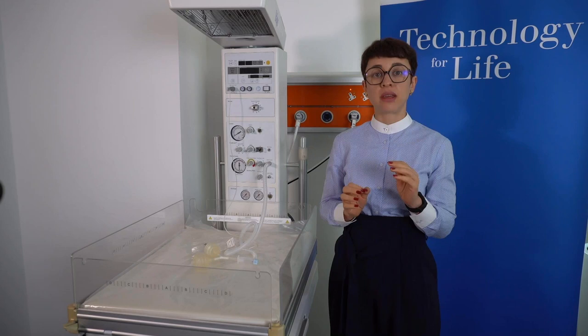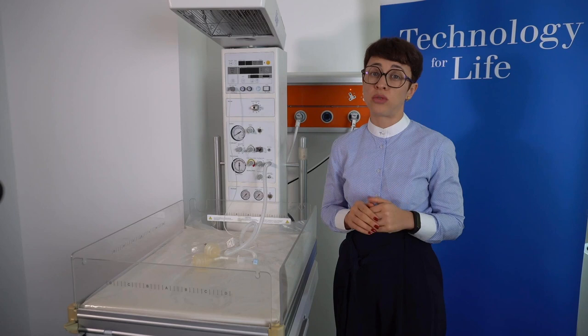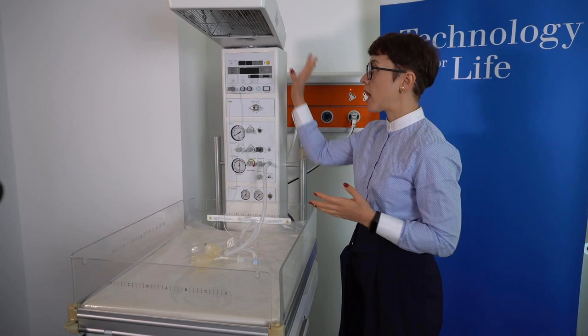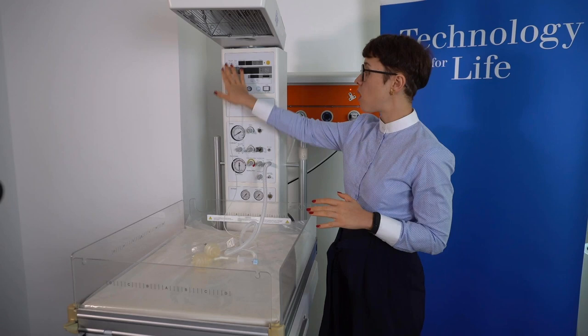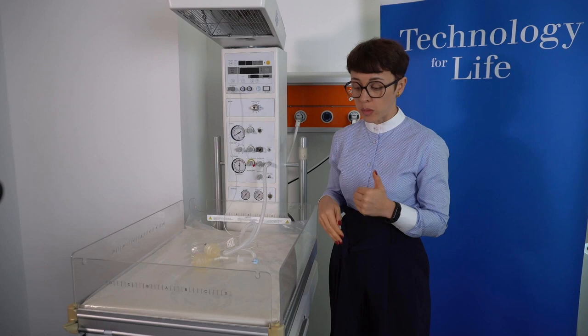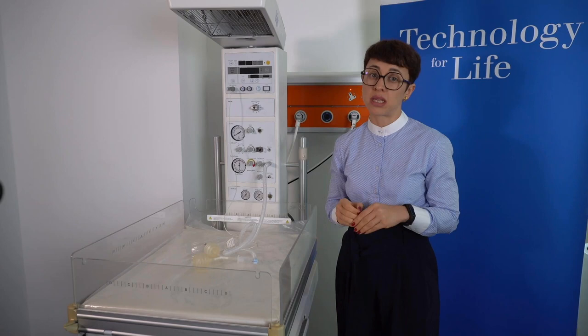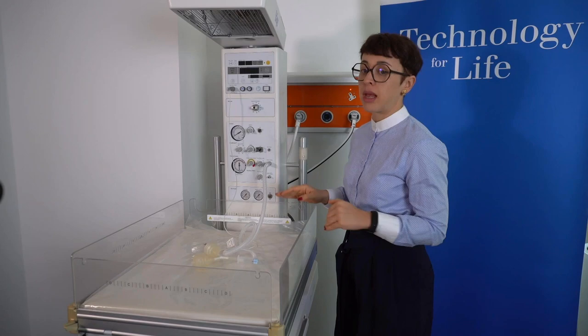And just to say that we're going to have some more time for questions and answers. So if you still do have questions, either technical or clinical, please still type them in and we will address them after this part. So as I mentioned, we have the resuscitator here consisting of the radiant warmer, the resuscitation module, and of course, the baby bed. So we have the possibility for the variable height adjustment, we have the drawers, we have the trays, but basically the main part that we are going to talk about today is the resuscitation module and how we can best optimize our resuscitation process. So let's have a look, what do we have here? And I'm going to switch to a closer look.